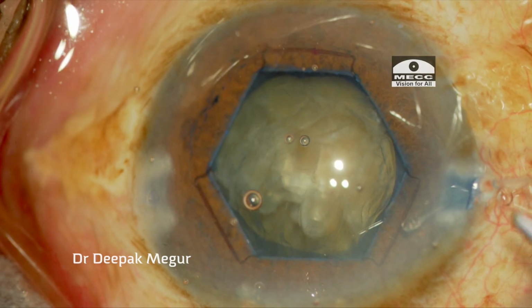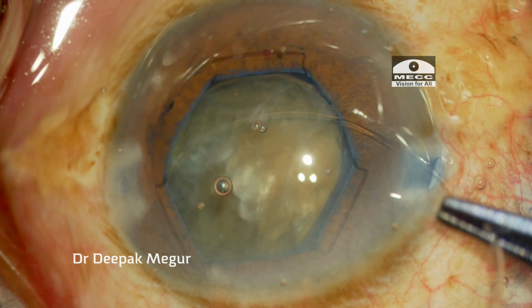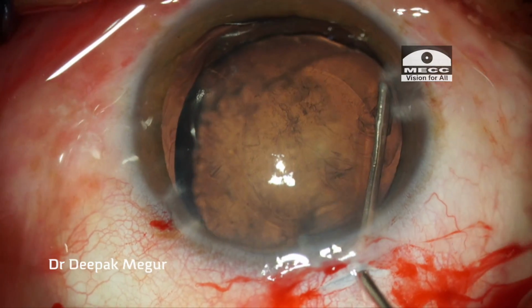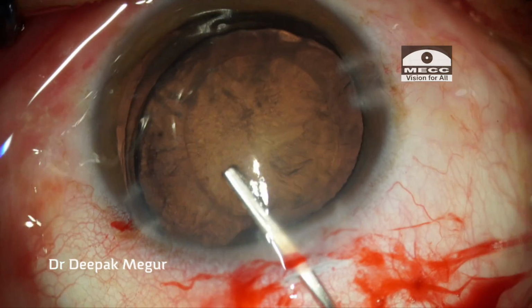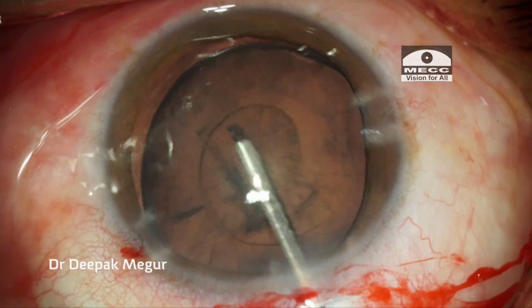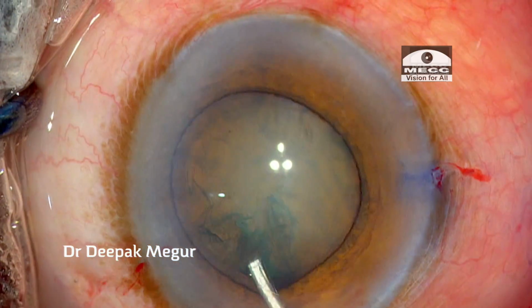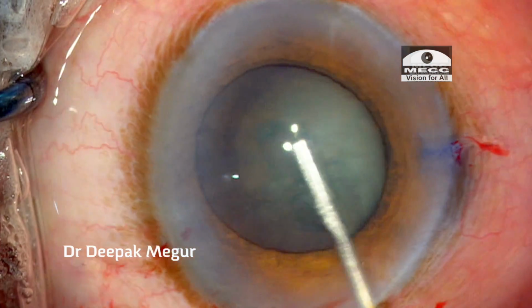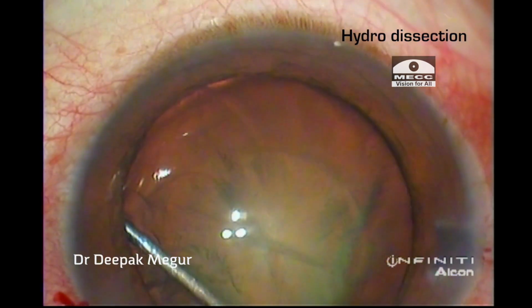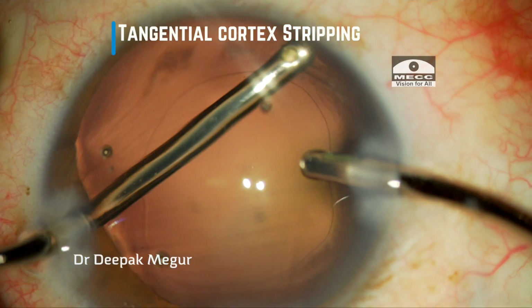Putting the ring before the nucleus removal can be intimidating, especially for the beginner surgeon. But there are a few practical tips which are very critical, and we need to understand them. One of them is to perform the cortical cleaving hydrodissection. Cortical cleaving hydrodissection before putting in the ring ensures easy insertion of the ring, minimizes the chances of the cortex being entrapped by the ring, and finally allows easy removal of the cortex even if the cortex gets entrapped in the ring. A slight modification of cortex removal technique will also aid in easy removal of the cortex.